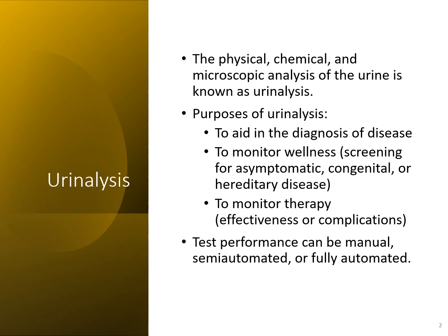We do a urinalysis to aid in the diagnosis of diseases, to monitor wellness, and to monitor any kind of therapy that may be happening. An example of this would be diabetes. It's often caught just on a routine screening when glucose is present in the urine.